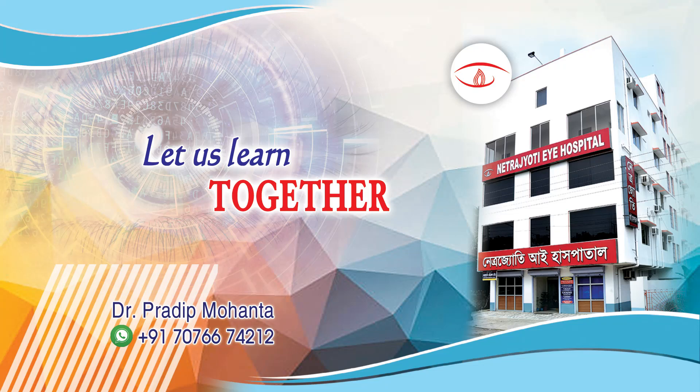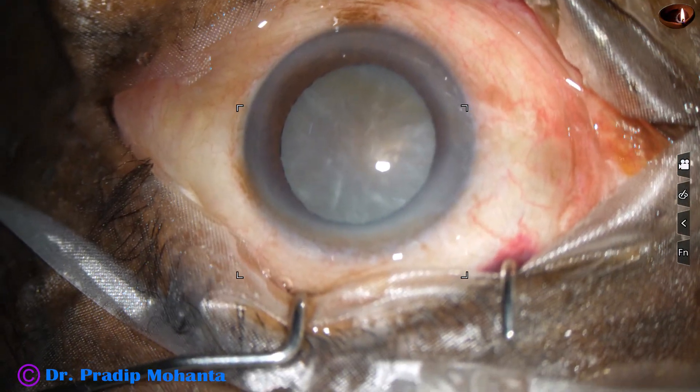Friends, in this video we are going to see management of an intumescent cataract with a very hard nucleus.